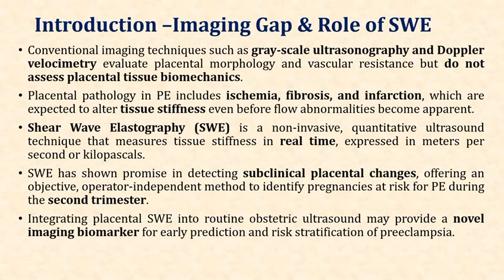Shear wave elastography is a non-invasive quantitative ultrasound technique that measures tissue stiffness in real time, expressed in meters per second or kilopascals. Shear wave elastography has shown promise in detecting subclinical placental changes, offering an objective, operator-independent method to identify pregnancies at risk for preeclampsia during the second trimester.